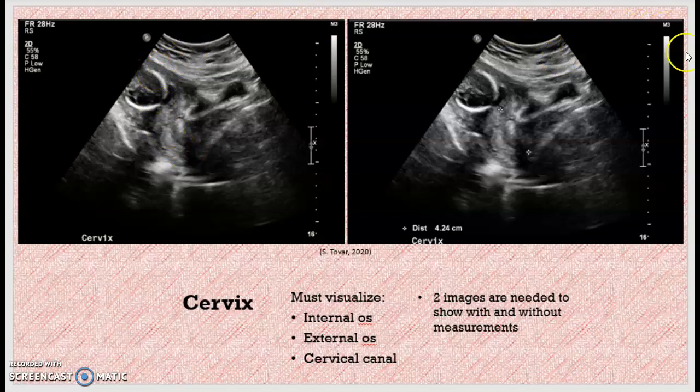On these, I think it's quite zoomed out on these images. I probably could have gone ahead and brought the depth in quite a bit.